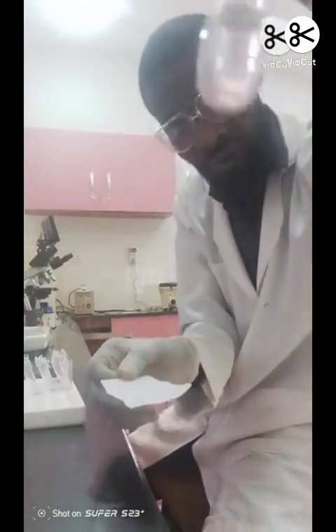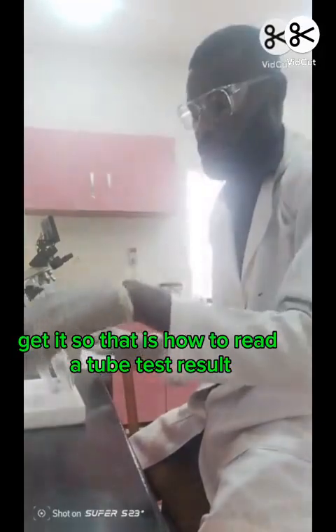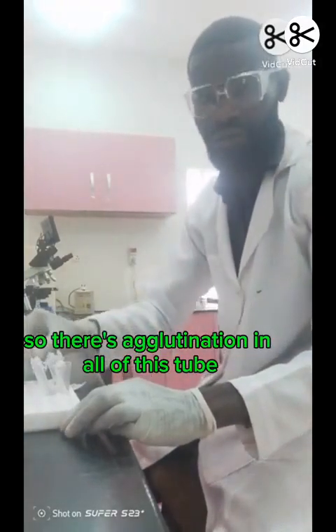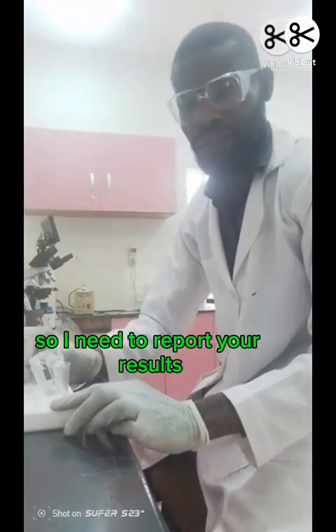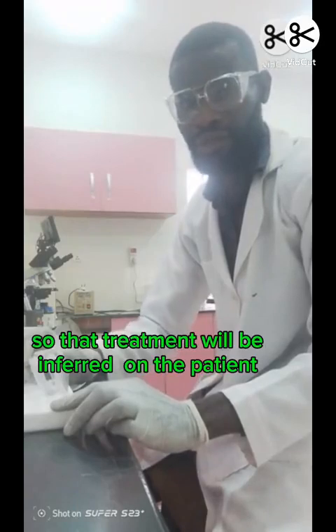So that is how to read the tube test result. There's agglutination in all of these tubes. So it is positive for typhoid fever. So you need to report your result so that treatment can be administered to the patient.